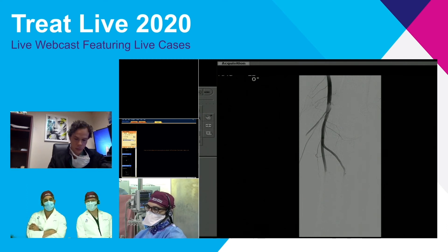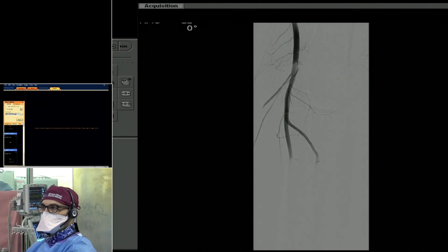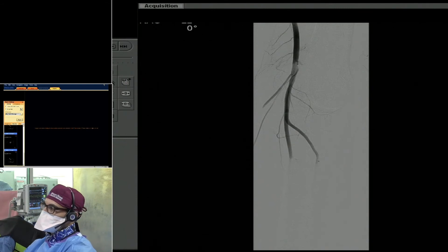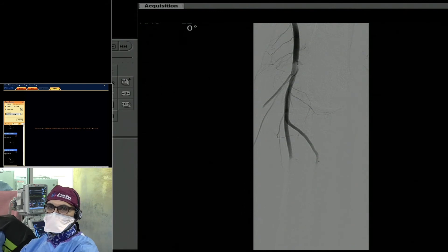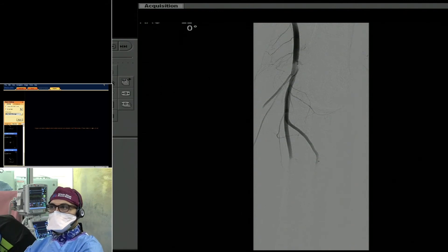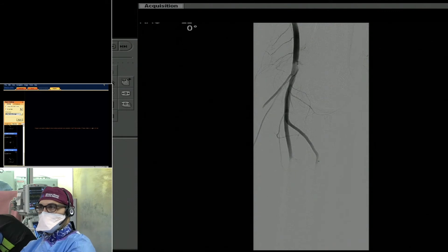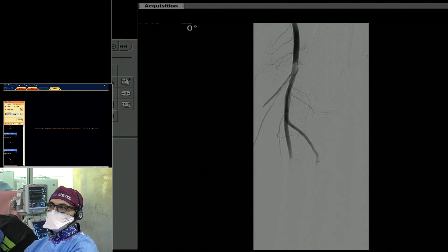At least based on fluoroscopy, it does not look like it's a heavily calcified lesion — it looks more like a soft plaque. This is progression of disease over the last year, and this is not an area we've previously treated. Given the runoff, I like to be conservative, and I'm leaning towards just angioplasty and provisional stenting here.